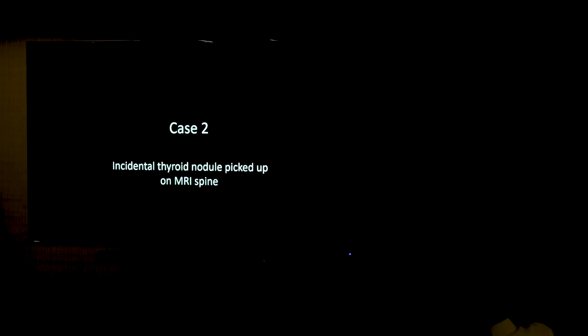So this is actually a surgical trainee. She was actually presenting with a different lump, but then we noticed this little thing here. So give it a U classification. Okay. And then it would get an FNA. So we'll come back to that case later. So case, if you're writing this down, that's fine.